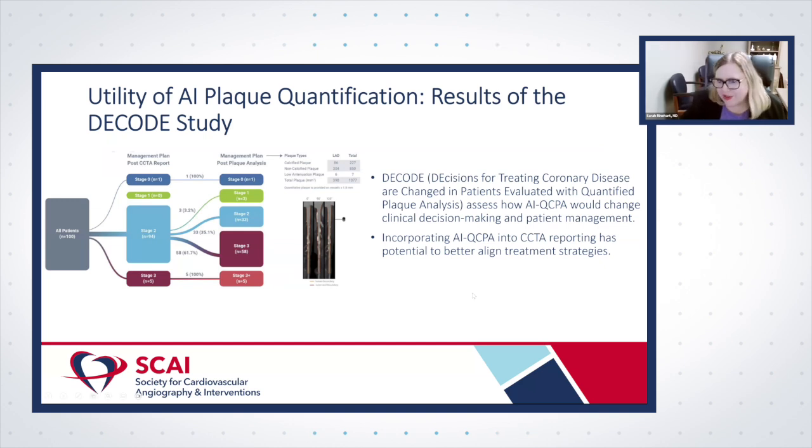So I'm the preventionist, the lipid clinic runner, manager in the room, not the interventional cardiologist. So I'm looking at how can we transform? And what we know today is we're not doing a good job at LDL lowering. What we do know from cardiac CT is that we're improving outcomes from the standard of care. But how can we leverage the plaque that we're seeing on CT to really take it to the next level, where we can drive LDLs lower by giving people concrete methodology?